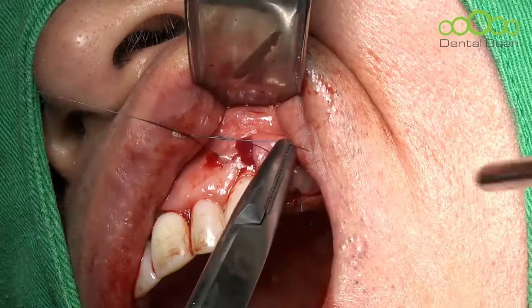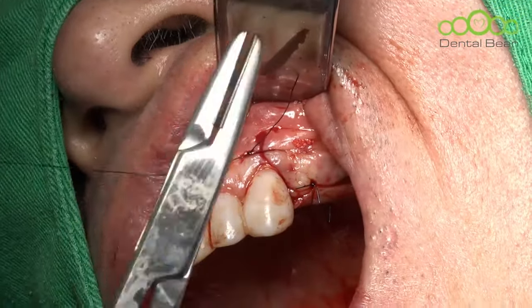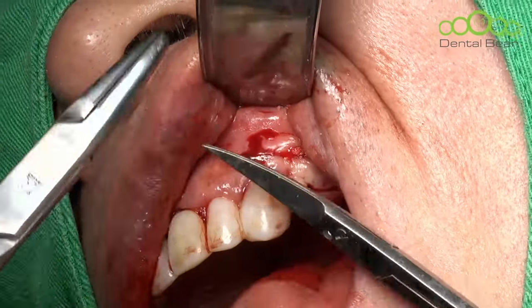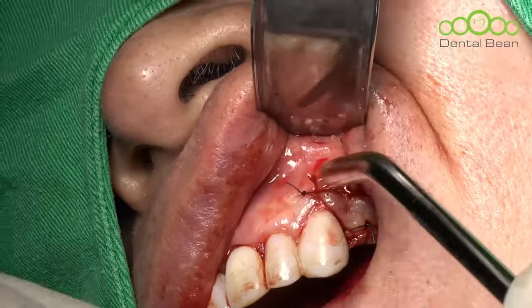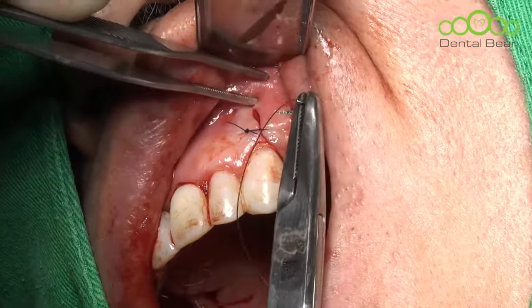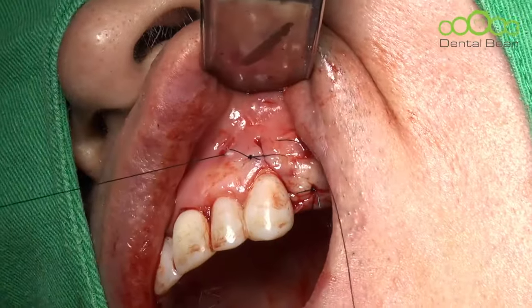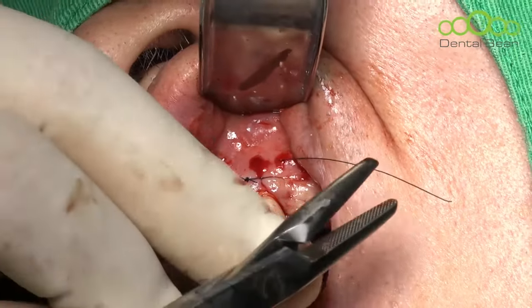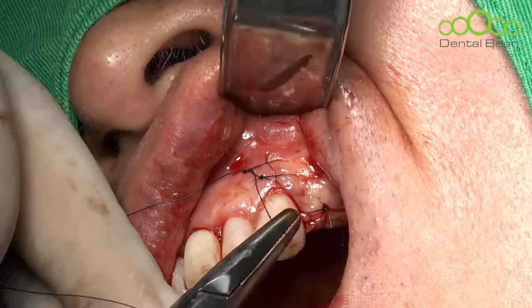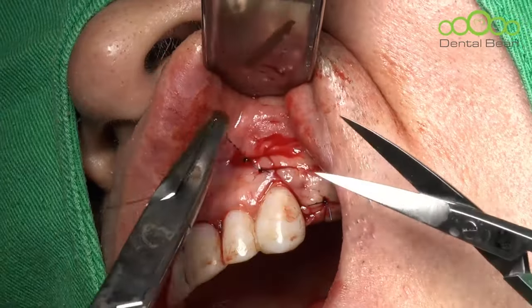Okay, during the surgery, I used two kinds of material. One is allogenic graft material. There are two types of basic allogenic graft material. One is FDBA, mineralized bone. This is better. In the past, we used DFDBA, demineralized bone matrix, bone allograft, but it is unpredictable. I don't like DFDBA. FDBA is much better. This is very nice. The outcome is very good.